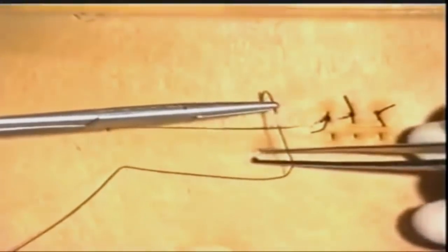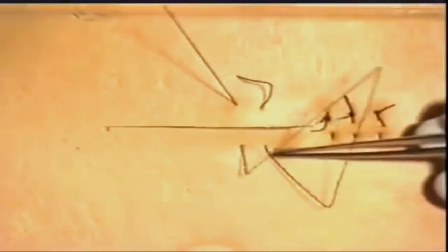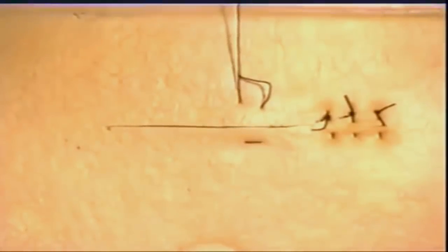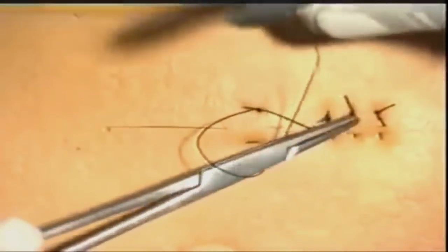We will now demonstrate the horizontal mattress suture. The initial suture is as before. Again, reverse the needle in the needle holder, but on this occasion move slightly horizontally and go back to the other side of the incision in a similar manner. One can see very clearly why this is called a horizontal mattress suture. Once again, the reef knot is tied in the standard manner and the suture material cut.